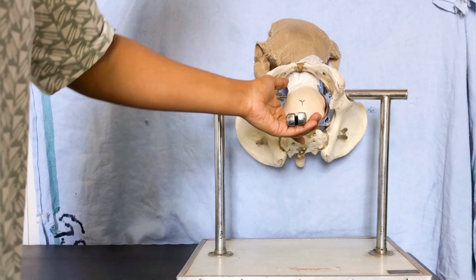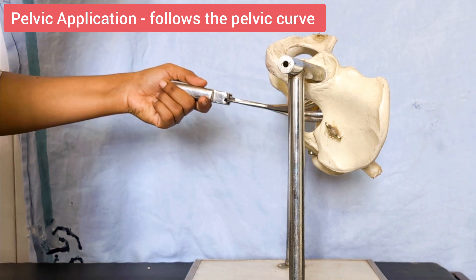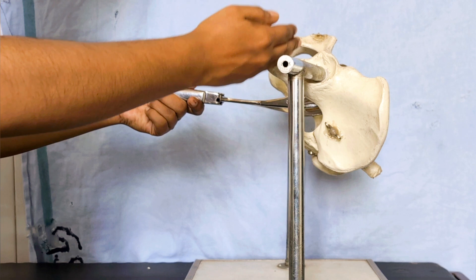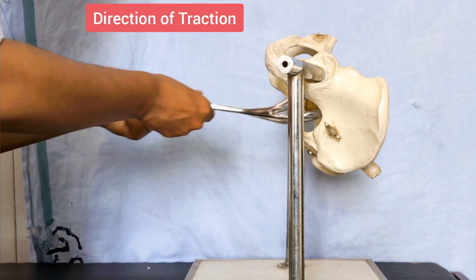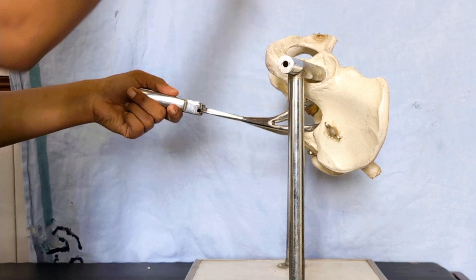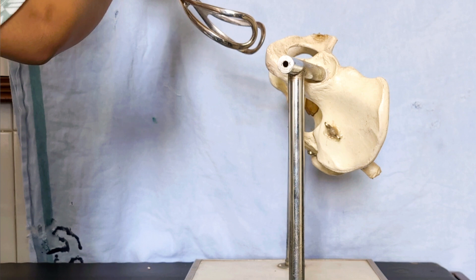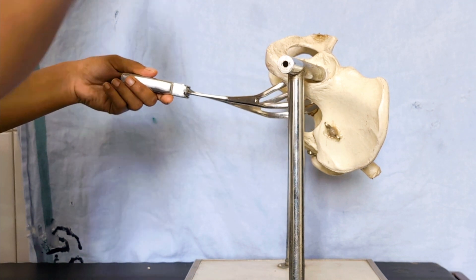This confirms our cephalic application. Now for the pelvic application — the forceps must be applied so they follow the curve of Carus. For outlet forceps, the direction of pull is first directly towards yourself at no angle, and then upward and forward at 45 to 75 degrees from the horizontal level.